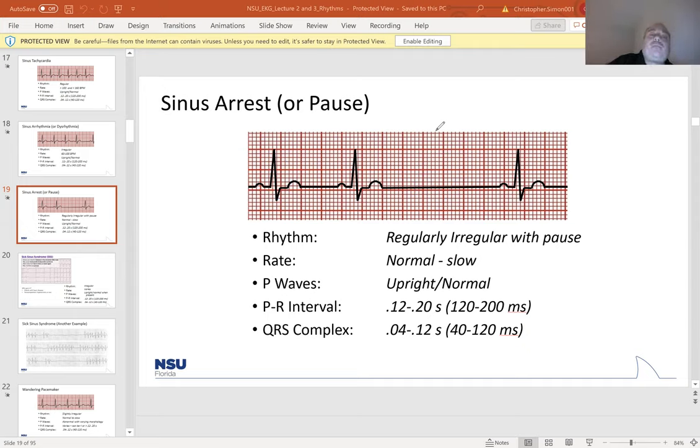So when you have a brief moment of almost asystole for like a second, we would say that that is a sinus pause. Now, what type of sinus pause it is just depends on whether it marches out, as we say, and we'll explain that in like 2 seconds. So, let's see, what else can I say about this? It's just something to be aware of, guys, clinically.